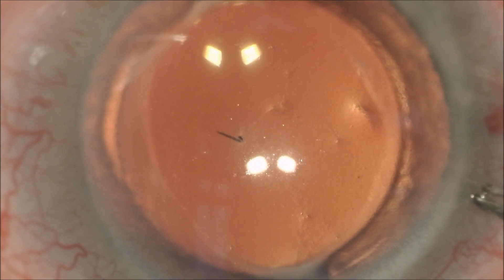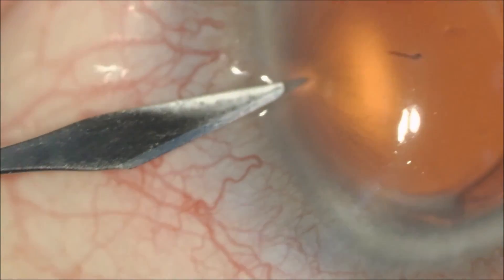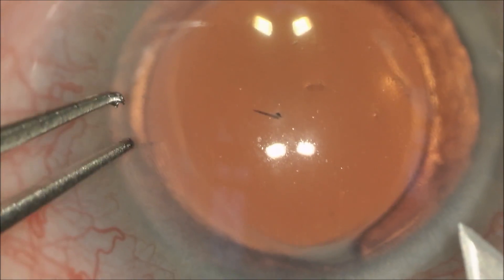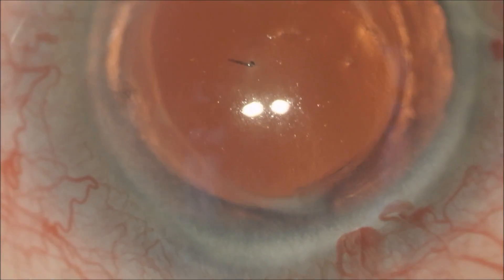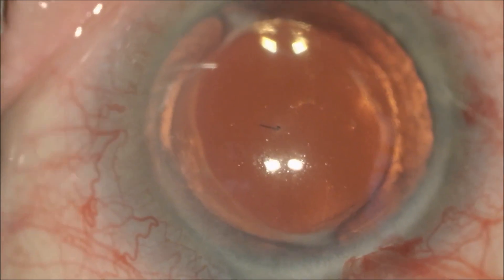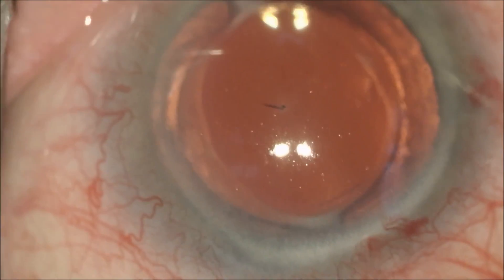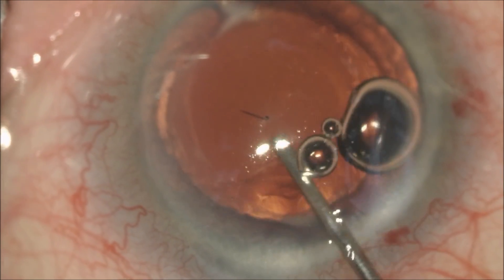Our idea is to isolate the barb with viscoelastic, a special substance to keep space in the front of the eye so we do not damage the delicate structures of the eye like the corneal endothelium. We've made our side port incision with a 1.1 millimeter blade. We're going to hold the cornea with our 0.12 forceps through the clear cornea incision and make a 2.4 millimeter incision with a clear cornea keratome. We're now going to inject viscoelastic in the front part of the eye after we put in some lidocaine local anesthetic that is 1% non-preserved to not damage the cornea.